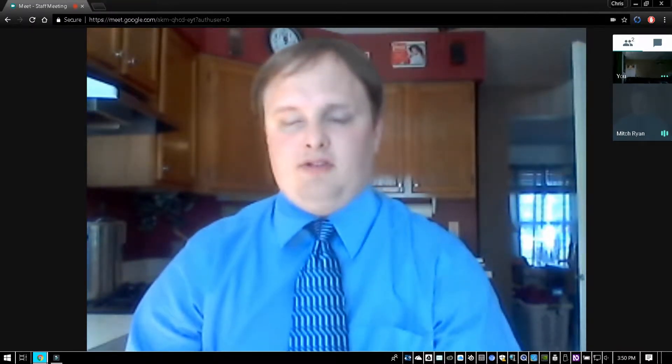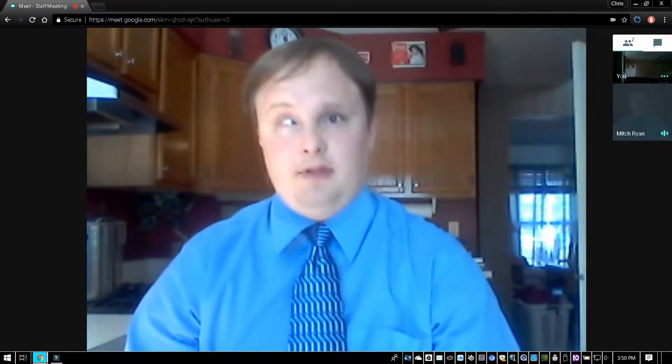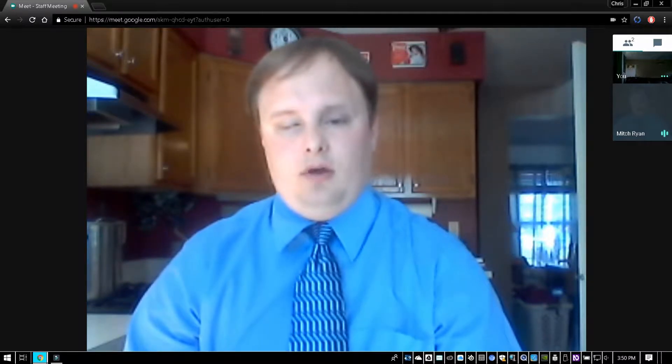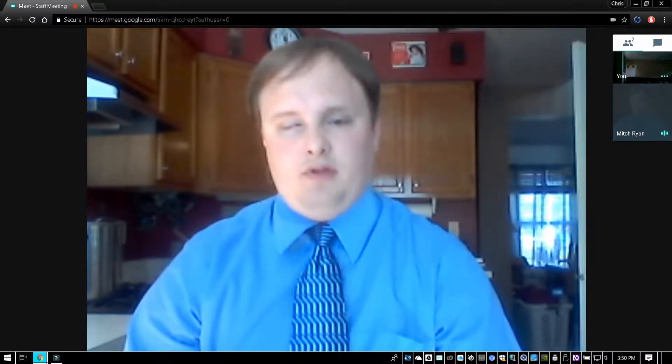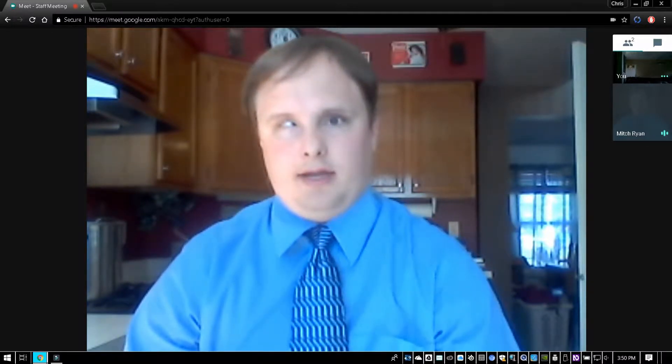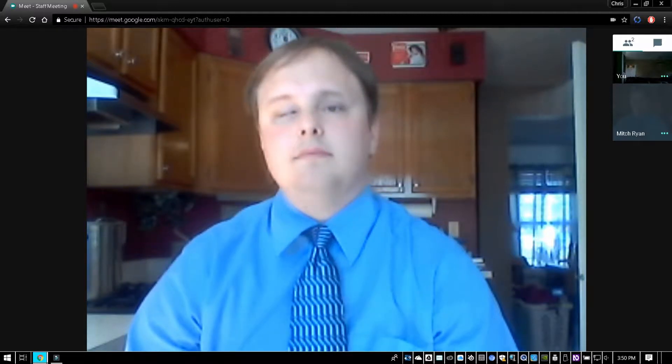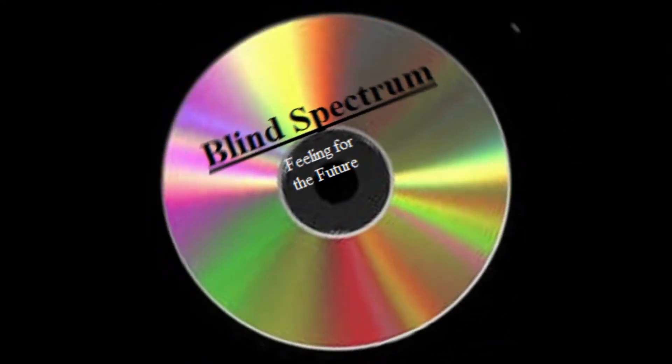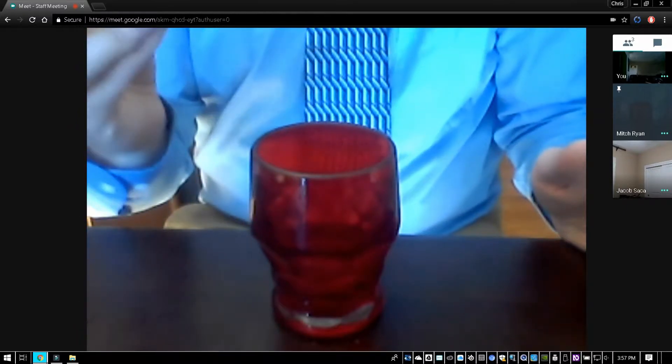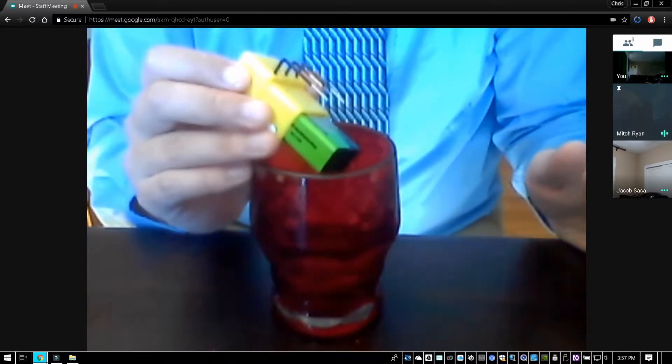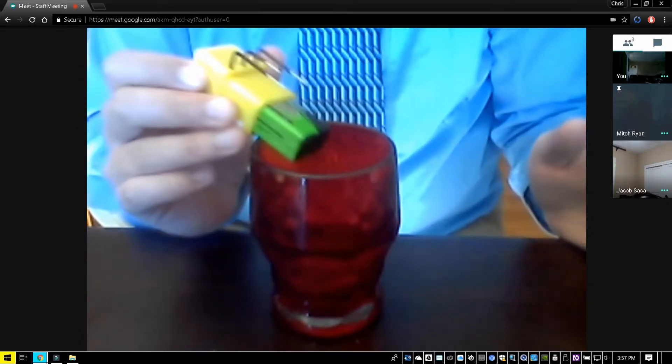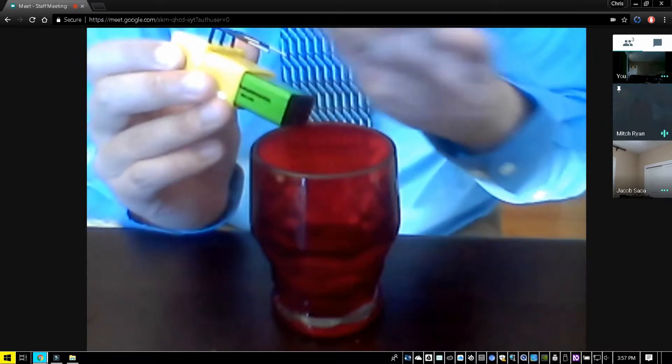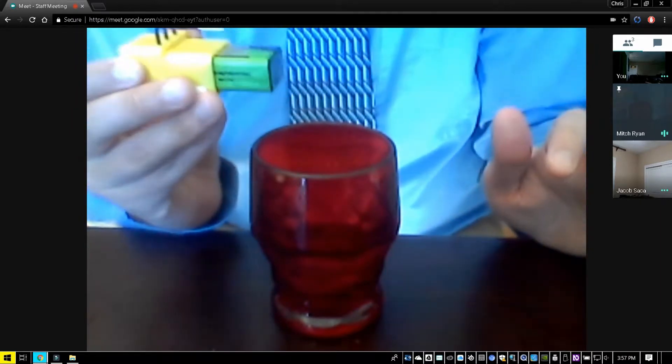Hello ladies and gentlemen, this is Mitchell Ryan with Blind Spectrum. In this video I'm going to be reviewing the liquid level indicator. This is the liquid level indicator - there are three prongs that you would place into the cup.